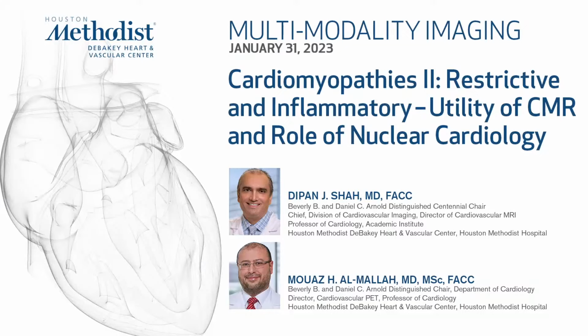Okay, so let's go ahead and get started. So this is the second of our two-part series on imaging of cardiomyopathies. And so last week, as you'll recall, we talked about the role of echocardiography, and we talked about the role of cardiac MRI in initial evaluation of cardiomyopathies.